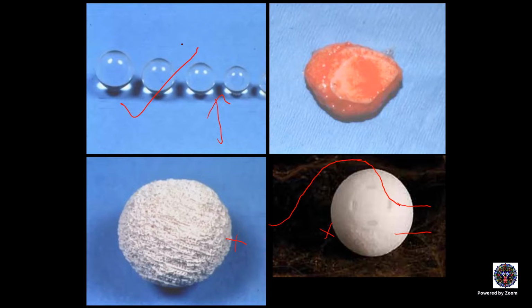Correct. So when you do radiation on top of an implant which is biointegrated, such as hydroxyapatite or porous polyethylene, what will happen to the implant? What does radiation do to the microvasculature of the implant? It will be extruded because of the... Absolutely, it will impede microvascular integration, fibrovascular integration, and it will lead to a dead implant which has a rough surface.